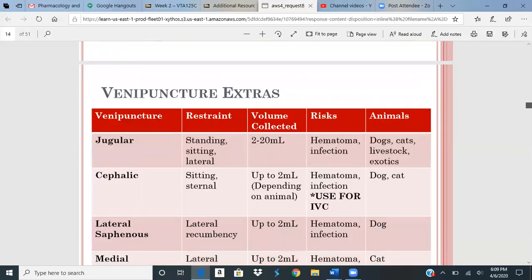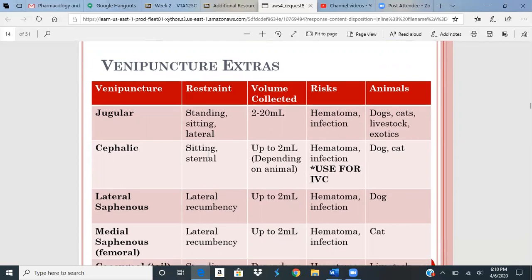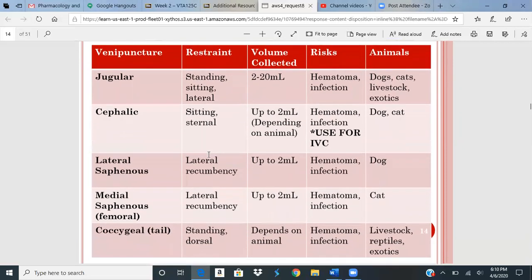Here's some extra information for you guys. So here's the restraint that we would use: standing, sitting, lateral. And then this is going to tell you the volume that you can collect from those areas. So we can do 20 mils of blood from the jugular vein.